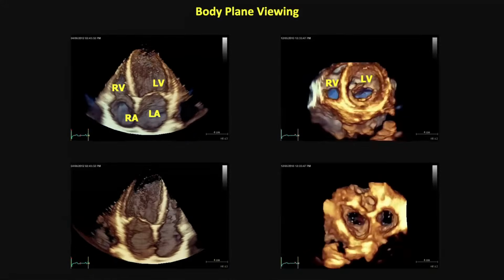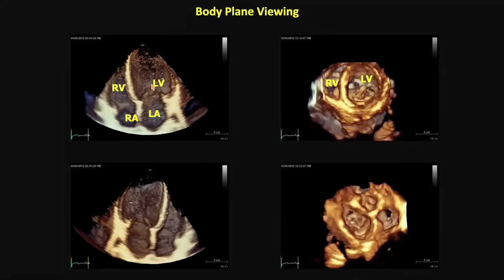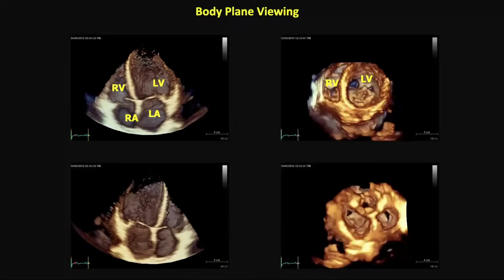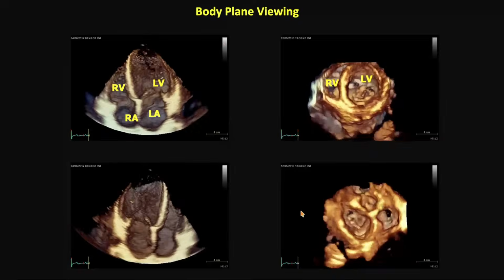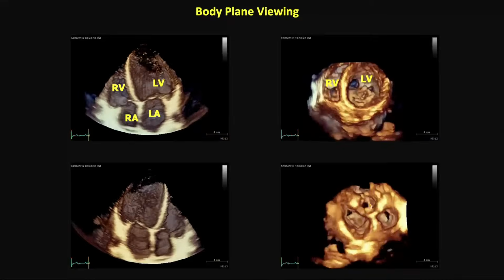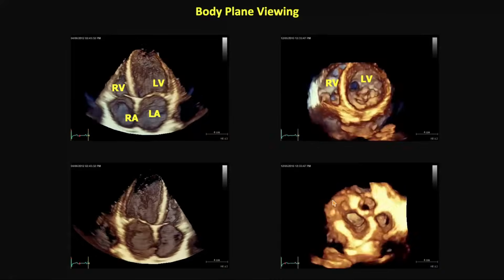And in terms of viewing, you can look at it transversely. So you can see that this is the coronal here, and then you have a transverse section. So you can look at it from different views, different sides. This is the reverse side of the 4-chamber here, the dual image. And this again, the transverse view, for looking at it from both sides, the atrial side as well as the ventricular side. So get this familiar.